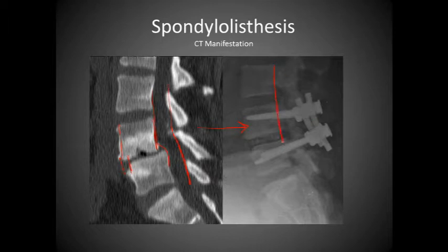And we see we have normal alignment. If we look at the posterior section and the anterior, it lines up very well. Here is the anterior. Notice we have an indentation. Posterior, we have to go outward as well. And so we do see that there is an abnormality here.